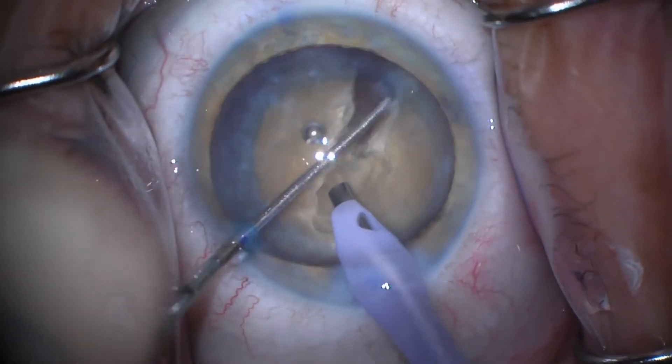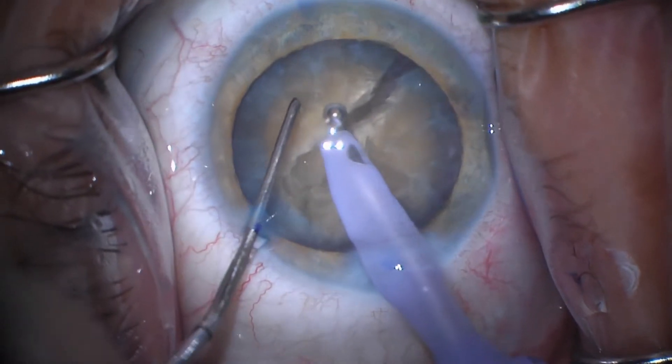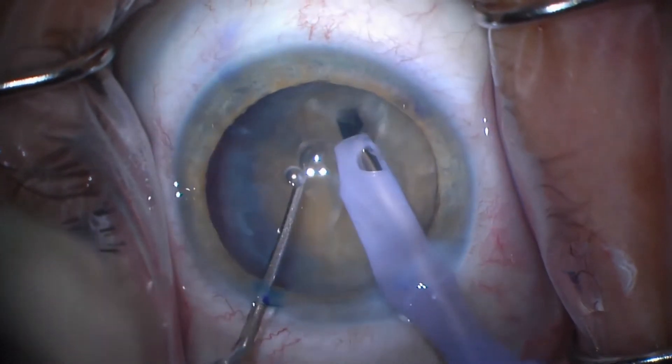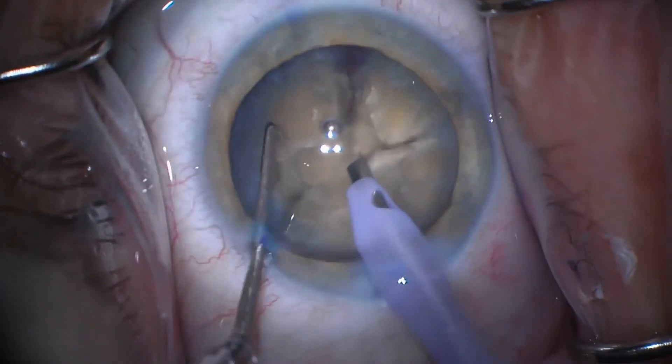I'm going to do some — we call it crossing our swords — where we reverse the direction of the force. And now I've kind of figured out how much force it takes, and you can see this little piece here is much easier. I re-embed into the nucleus and I'm able to chop that in two.